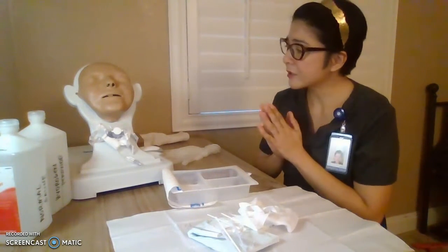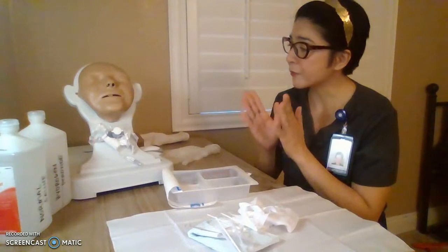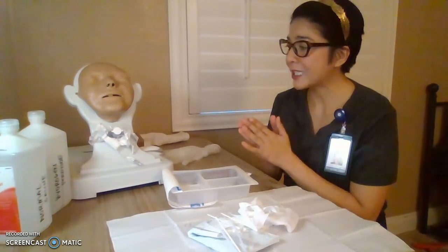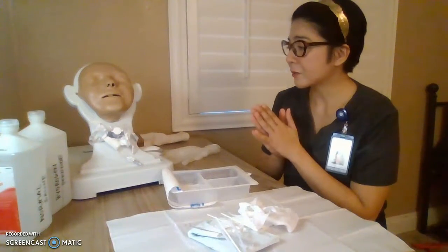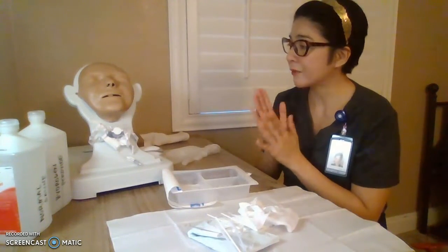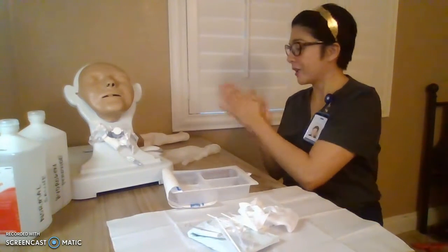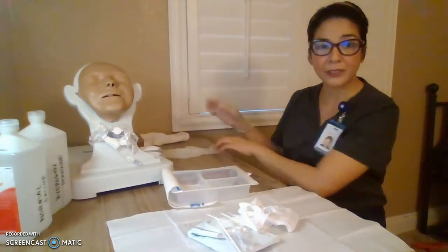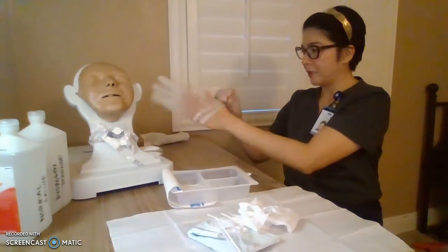So Mr. Smith, I'm now going to start the procedure. First thing I need to do is to remove your inner cannula so I can clean it. But anytime that you feel uncomfortable or any pain, let me know by raising your hand. Okay, so hand hygiene, we're now donning our clean gloves. We're not doing sterile yet, it's only clean. All right.